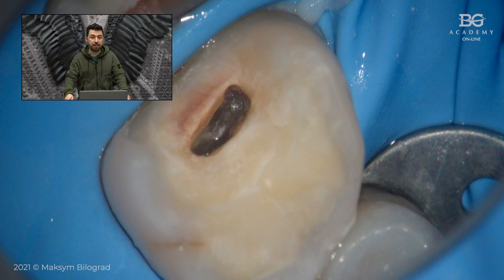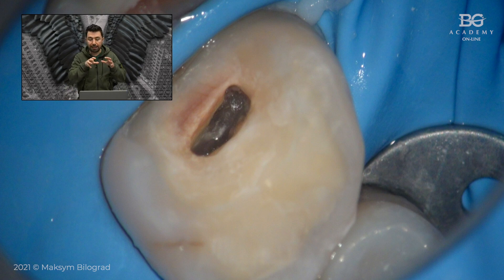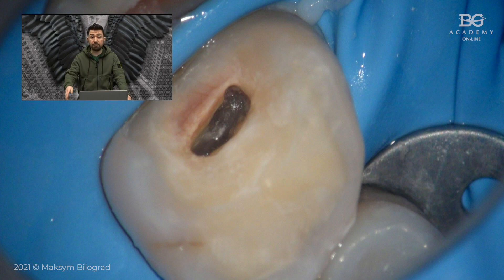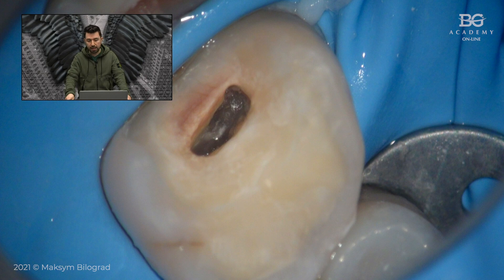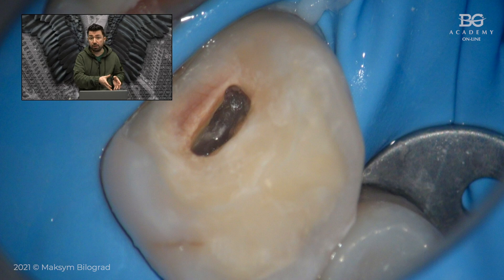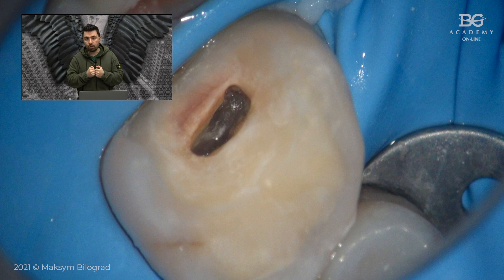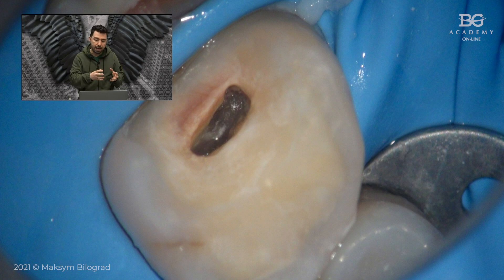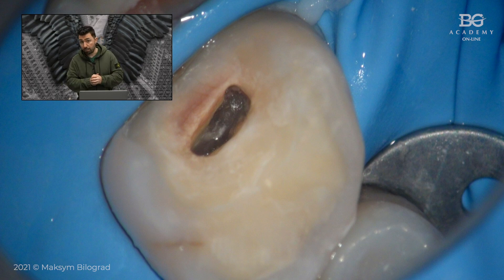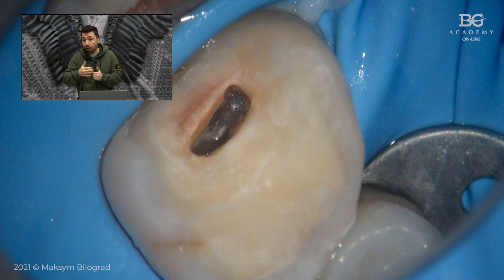We have to do access that will let us execute the next step easily. For easy root canals, I don't need to make my access wide — I can do root canal treatment easily because I have a straightforward canal. I do scouting, I determine what type of root canal I have, and according to this I start to vary my access preparation. I can start with conservative access and end up with straight-line access because of the difficulties encountered.